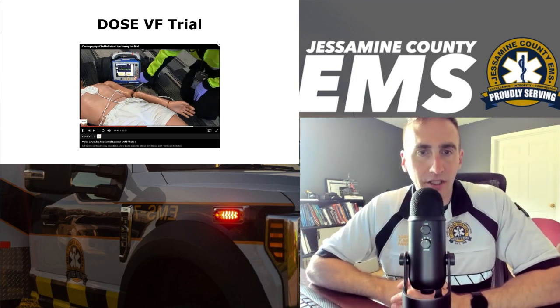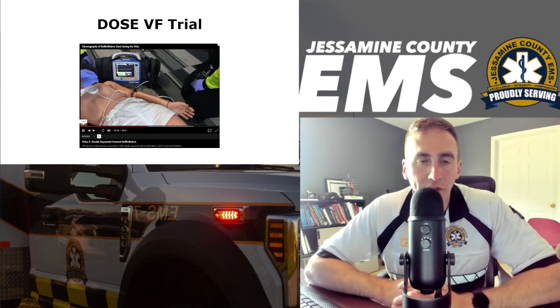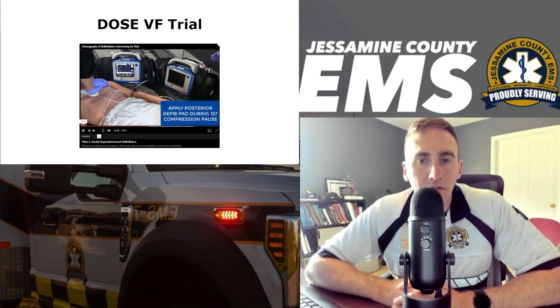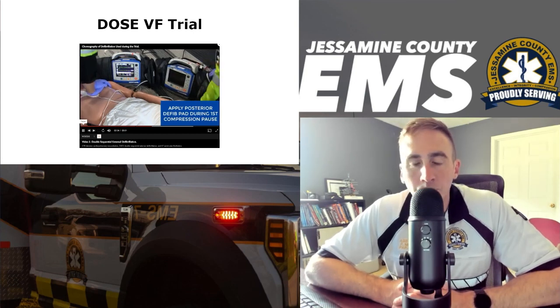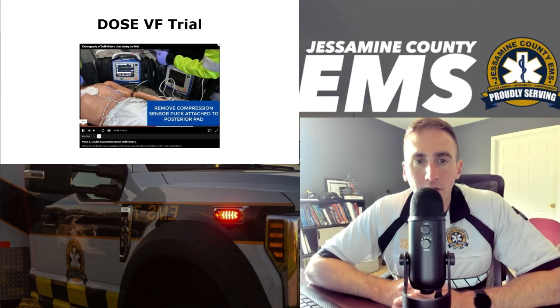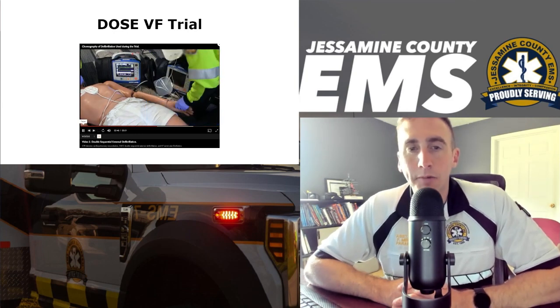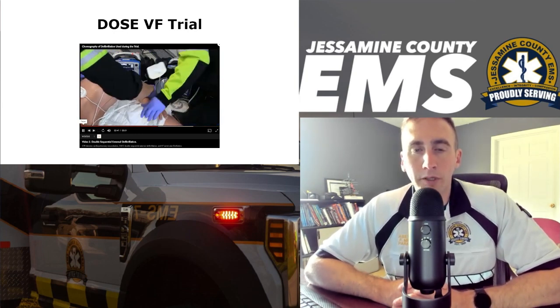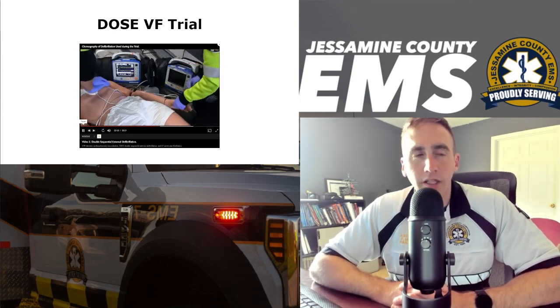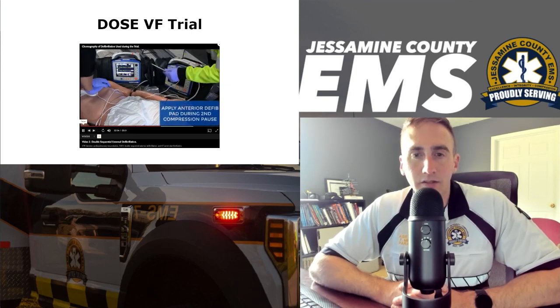For some reason, I don't think the sound was recorded, but you see them with the standard position here. It looks like they gave their final shock. They're taking a second monitor. Both sets of pads have the puck, but you only need the puck on one monitor. You can see how they're pausing for a prolonged amount of time to place the pads, and we're going to do it in a way that I think will result in fewer pauses.